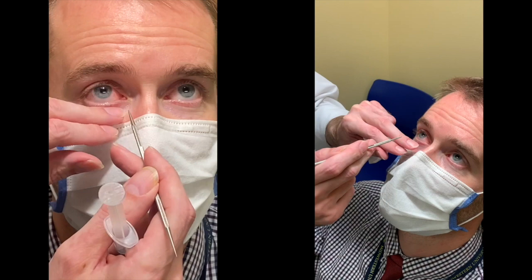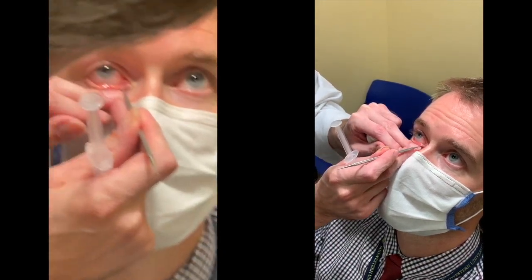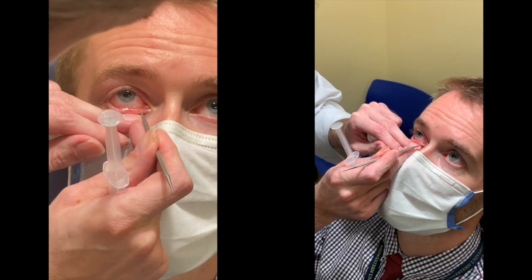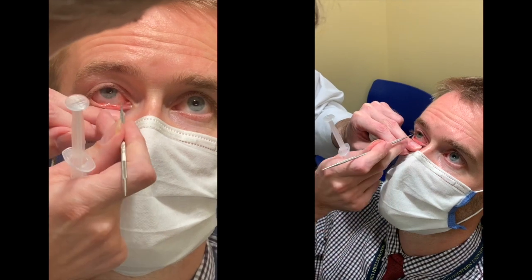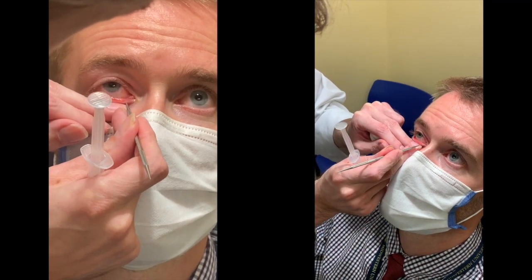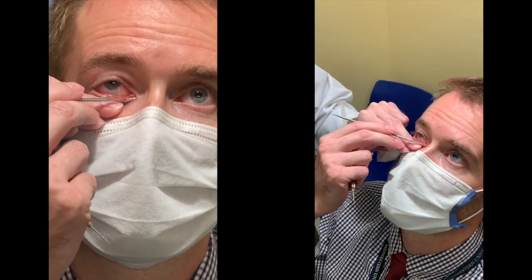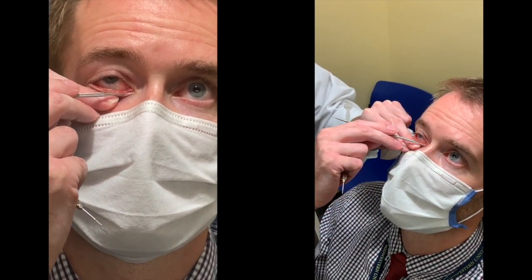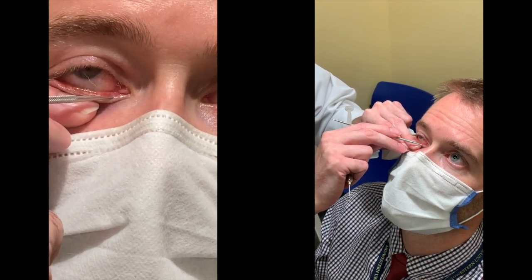I tend to use my one hand to avert the lid and at the same time stabilize the dilator so that it doesn't slip and I have an easy time inserting the dilator. Using loops can be very helpful in this situation. After entering, I turn the probe towards the nose and then use a small circular motion and push in order to dilate the punctum as much as possible.